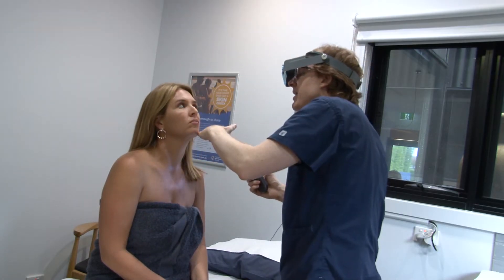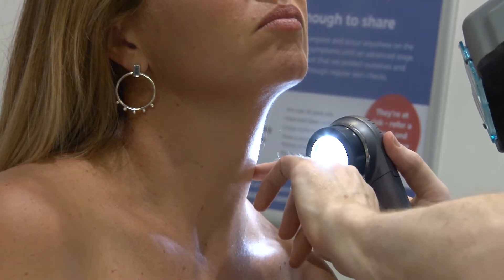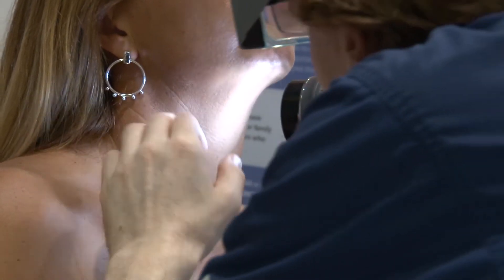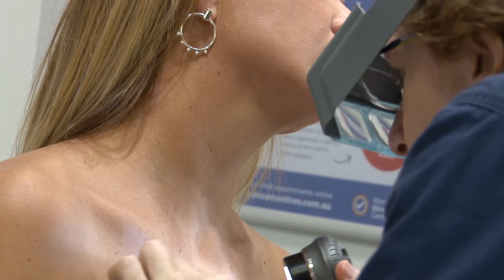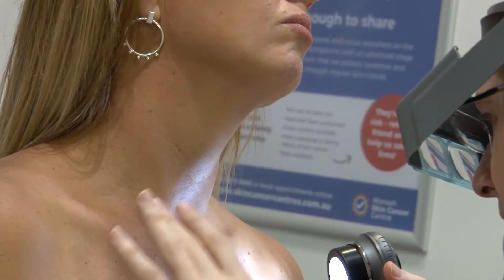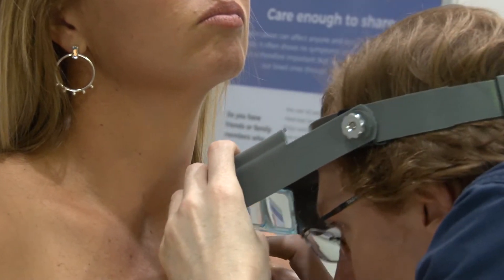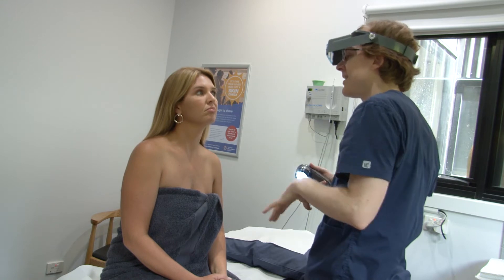Then it's down to the neck as much as you can. You've got these little freckles on your neck — nothing there is particularly scary. I'll have a little look around the front of your neck, just turn your head a little bit for me. Lots of normal looking moles that wouldn't hurt a fly. Don't worry about this little one here — this is the same as the thing on your forehead, the little red spot. You've got freckling all over there. Your head and your neck are as they should be.